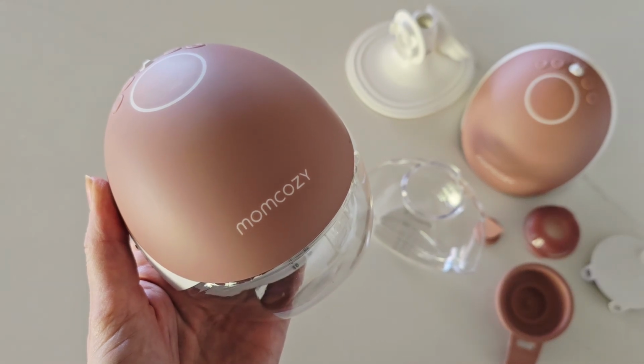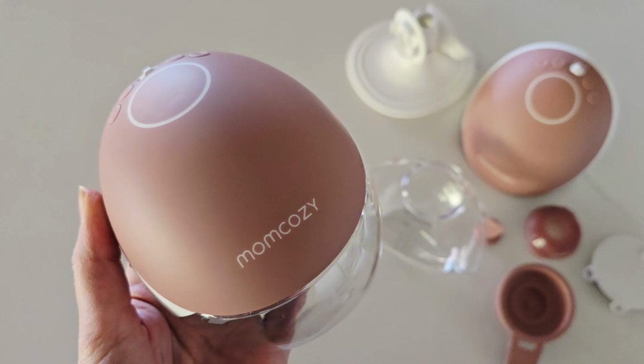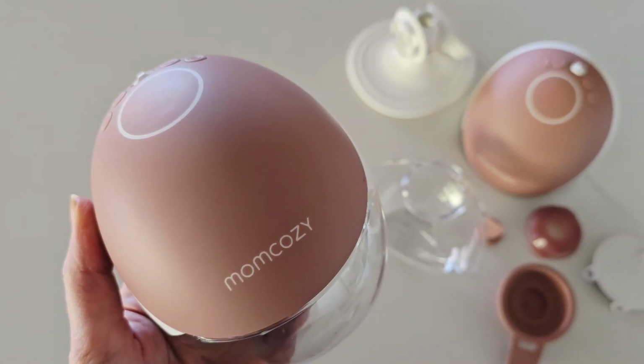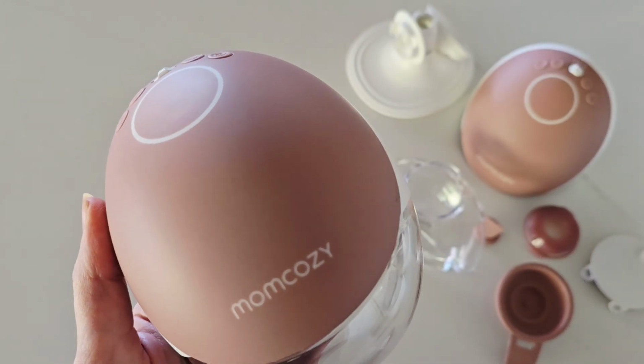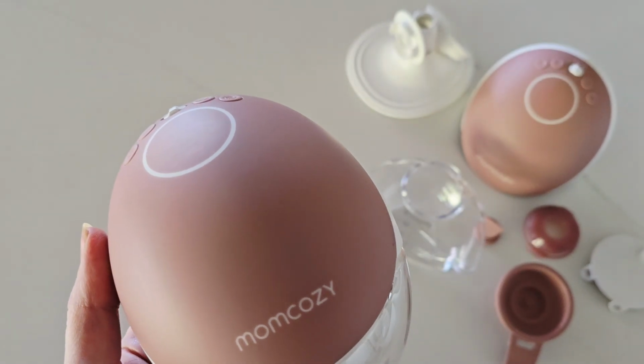Wondering how often to replace Momcozy M9 parts? Well, stick around. In this video, I'm going to walk you through which parts need replacing and how often. But let's start by talking about why these pump parts need to be replaced regularly.